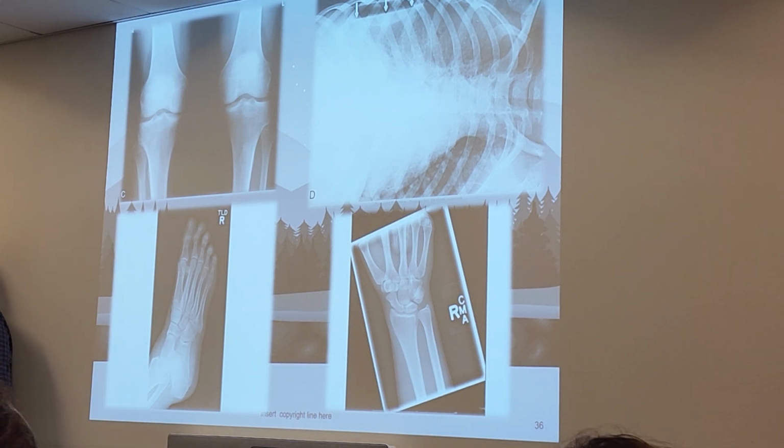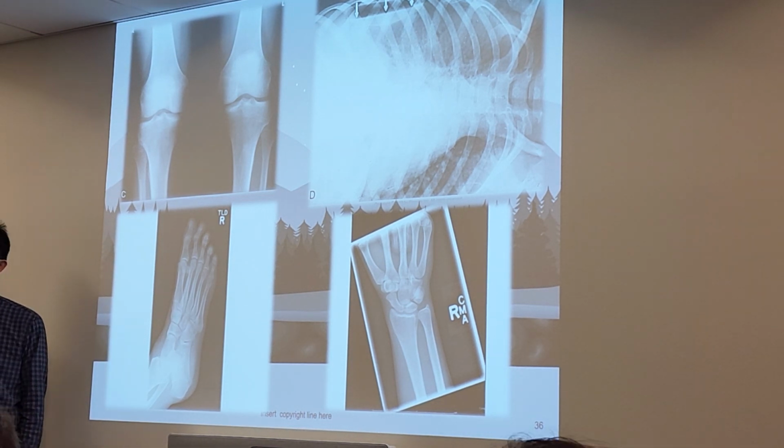And of course, what happens if someone's feeling a bit malicious and decides to put your initials on an image that they did? So you don't want to use digital annotation, only physical markers. Is there any way to disprove that it wasn't you who took that image, if someone were to do that malicious thing that you said?